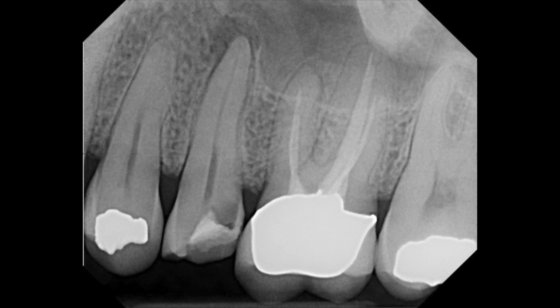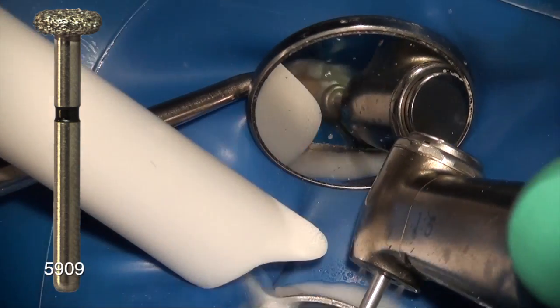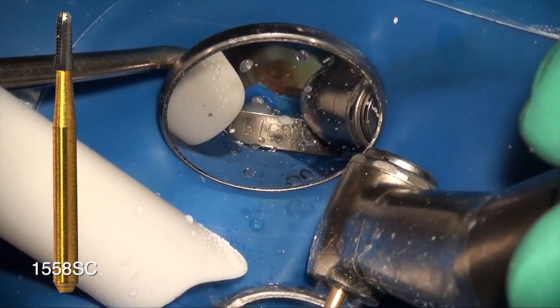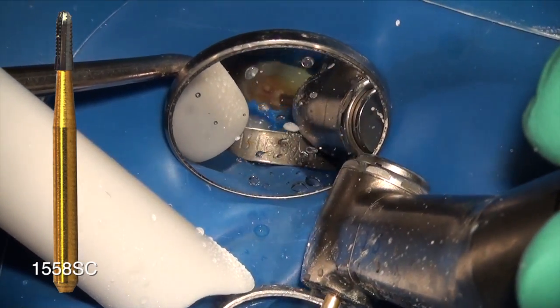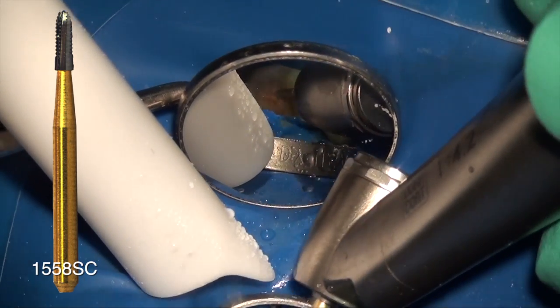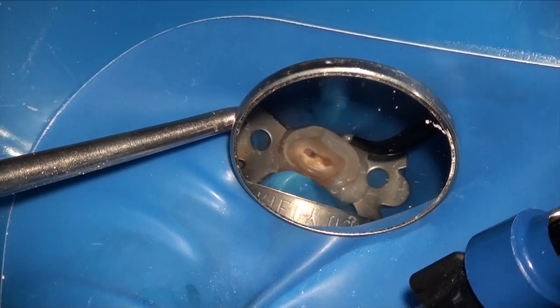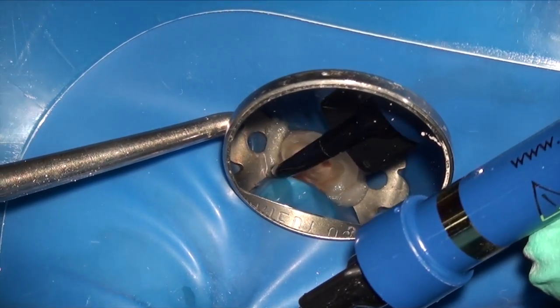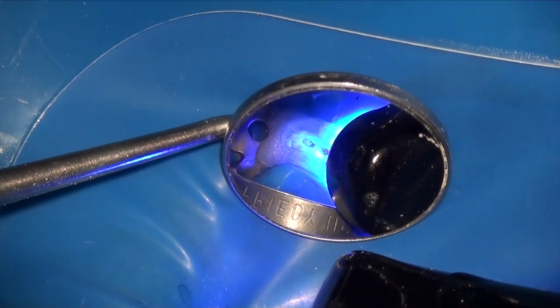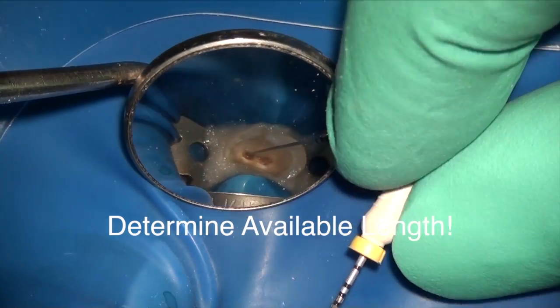And as usual, we start with the same protocol of using a flat diamond disc to flatten the cusps. What this does is it allows us to have stable reference points and reduced occlusion. I then use the saber cut, the 1558 SC bur from the Real World Endo Access Kit. This is a very efficient bur in terms of removing decay, creating an outline form, and giving yourself a very good quick preparation. Once the decay has been removed, now it's time for our final isolation using Opal Dam or whatever material of choice you have. We cure it in place, so now we have a good isolation.